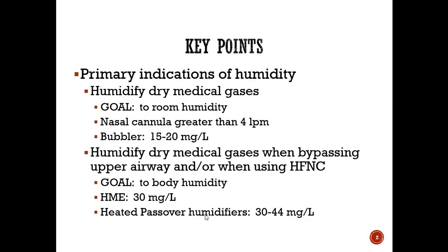When you're thinking about that, you're really thinking about your nasal cannula of greater than 4 liters per minute. And when you're talking about room humidity, you're essentially getting that medical gas to the same level of humidity as the surrounding environment. Okay. And then after that, you're relying on the nose and the mouth and the natural mechanisms that your body has to humidify the rest of the way before the air reaches the lungs.